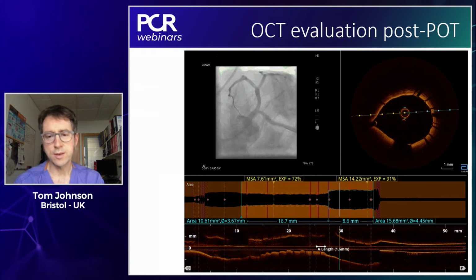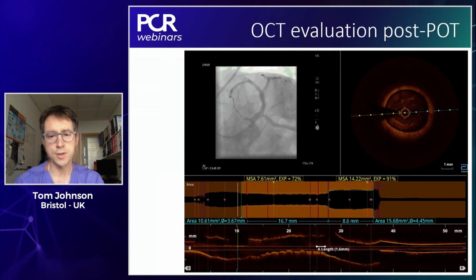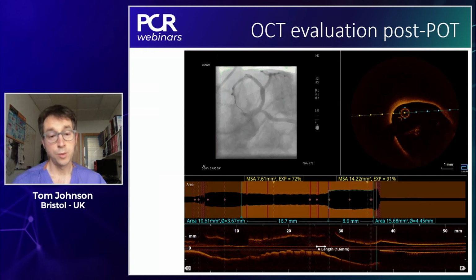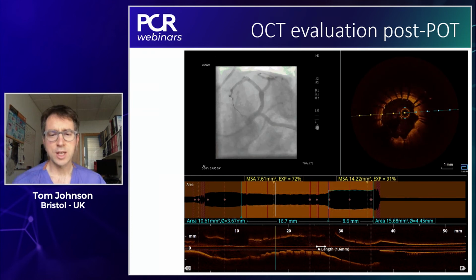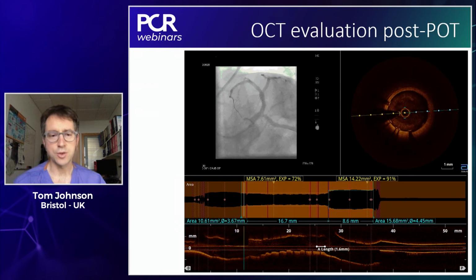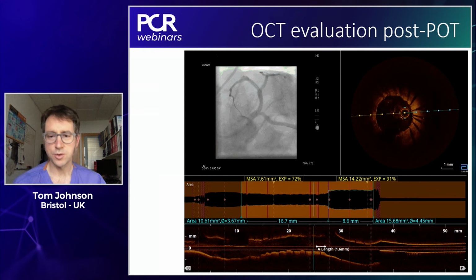So we see then with that bulky thrombus that there's a degree of protrusion of the thrombus through the struts. In fact, if you just focus on the lumen profile, the brown band across the center of the image, we see that we have a minimal stent area, which is very acceptable, of over 7 millimeters squared in the LAD. But actually referenced, its expansion is only 70%, and so actually significantly less than we should be attempting to achieve. And again, this hints at the danger of using the numbers. So I think we have to focus here on trying to better optimize.